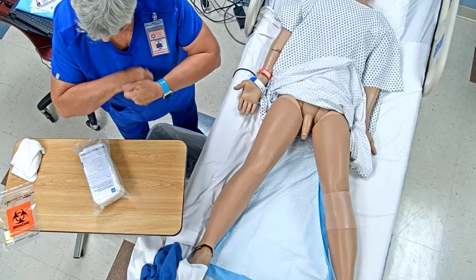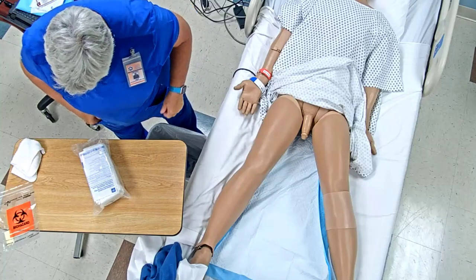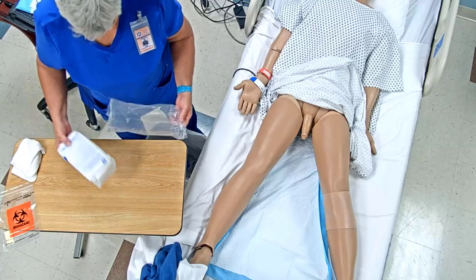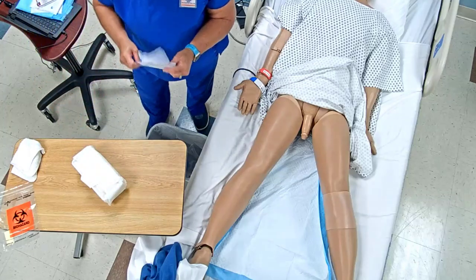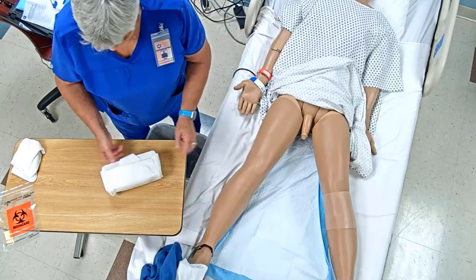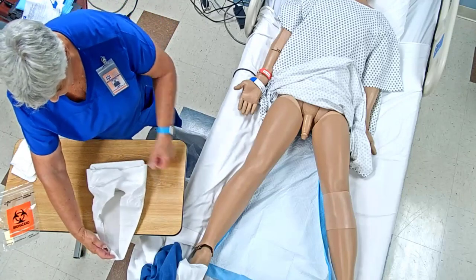Okay, so I've already checked my supplies. And we're going to remove our package. I'm going to put that over on my computer as well, so I'll use that to help me with my documentation. And so you want to always open away.